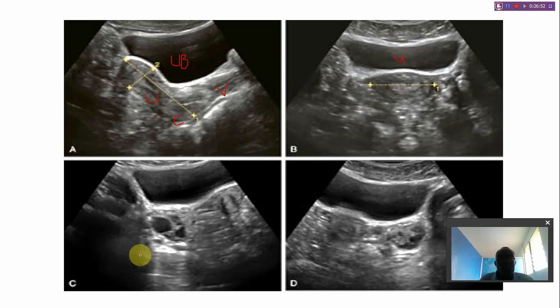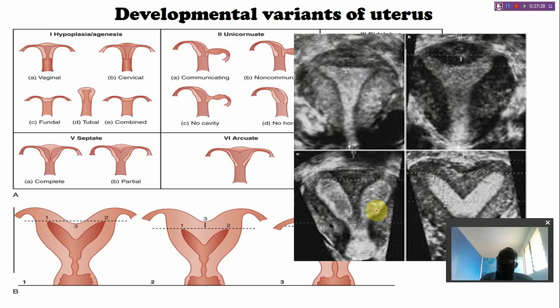This is the bladder. This is the right ovary. The right ovary is here. The uterus is here. This is the left ovary. The left ovary is here. They are showing normal follicles at the cortex. You can see a maturing follicle, or a dominant follicle, or a Graafian follicle. You can also see other follicles at the cortex. This shows a normal phenomenon of functional follicles. They are not abnormal ovarian cysts. They are normal ovarian cysts.